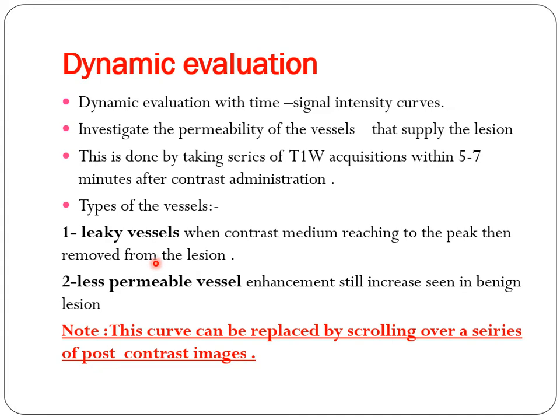Just one clarification. It's taking a series of T1 acquisitions within, not after. So you start the acquisition and you finish within 5 to 7 minutes, not after 5 to 7 minutes. If you do it after 5 to 7, the contrast is gone and there is nothing. So you inject contrast, you start the acquisition, and the acquisition will take somewhere between 5 to 7 minutes.